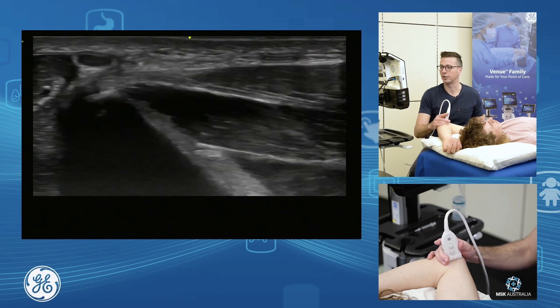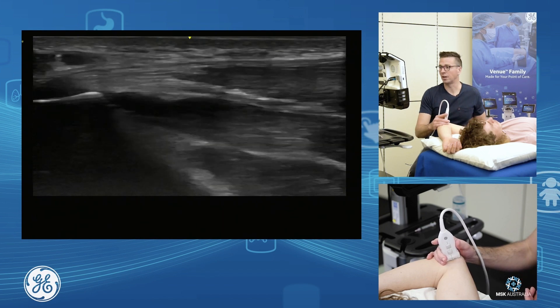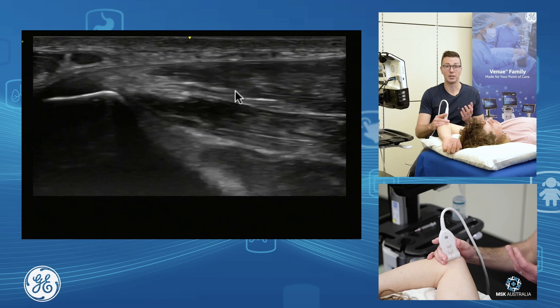I fan through that enthesis so I can do enthesis assessment, proximal tendon assessment, and I can assess the proximal musculotendinous junction. There's our common flexor.